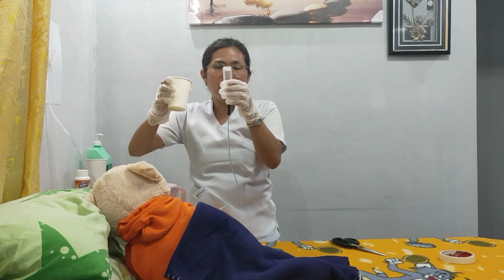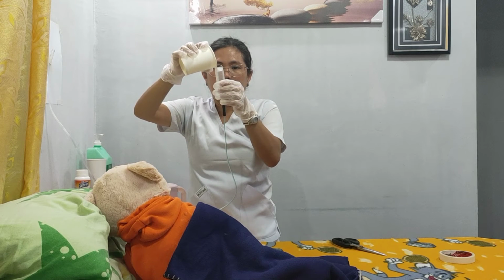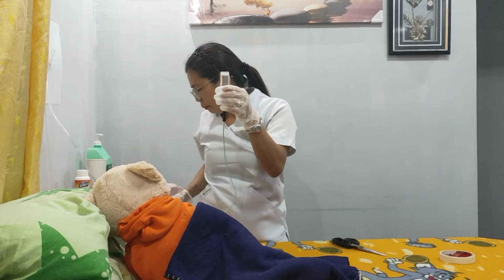Complete the feeding by flushing 20 ml of water or as prescribed. Then, close the feeding port with a stopper.